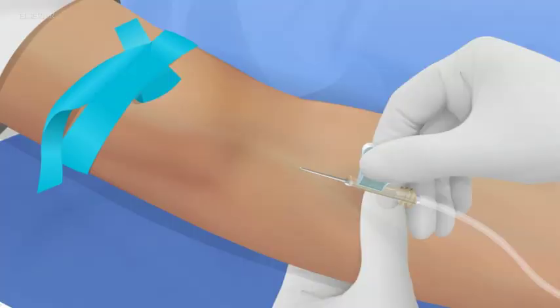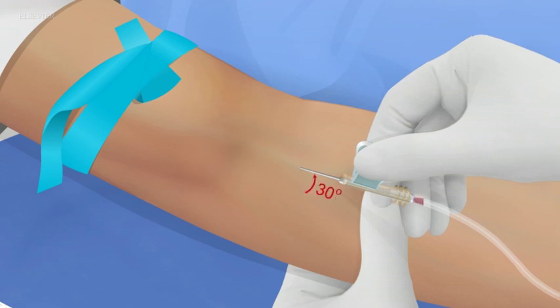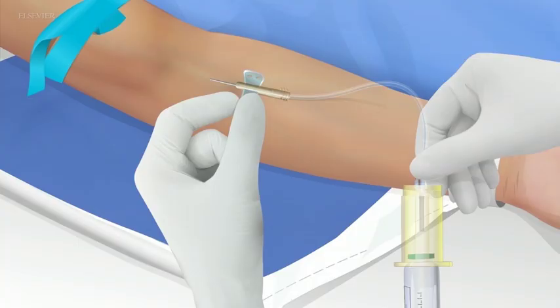Hold a butterfly needle by the wings. Hold a straight needle attached to a syringe at the hub. Insert the needle at a 30-degree angle with the bevel up, just distal to the selected site. Slowly insert the needle into the vein. Winged butterfly needle device method.